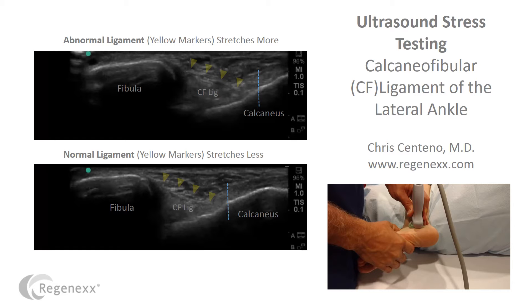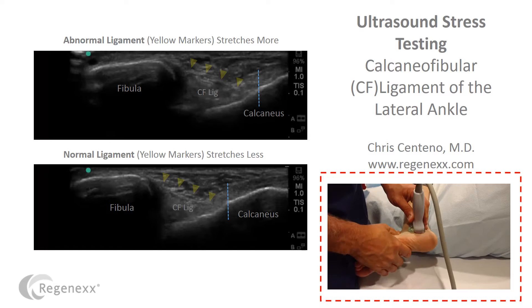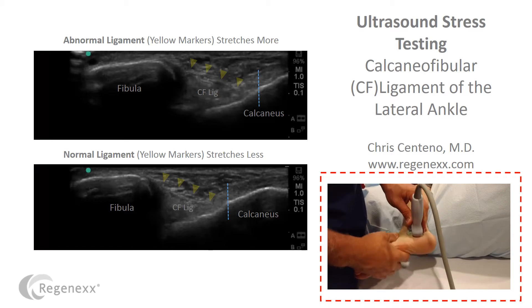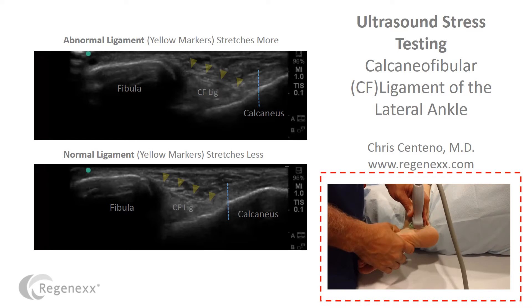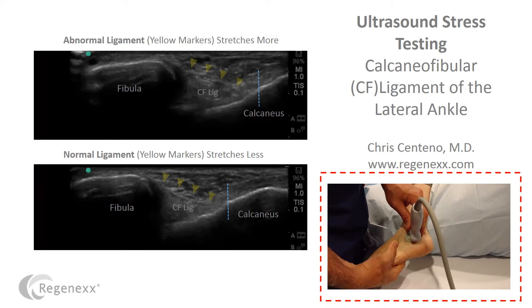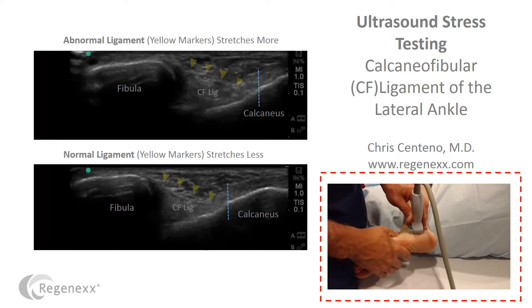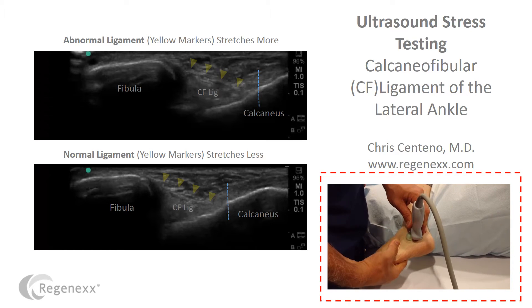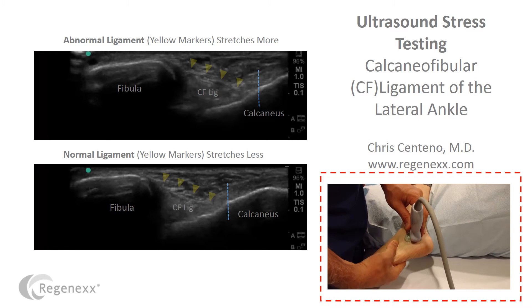You can see here on the lower right, I'm performing a stress test of the ankle. What I'm doing is stressing the ankle ligaments and looking at them with ultrasound to try to get a sense of how they hold up. When we go and walk around or run, we stress those ligaments.